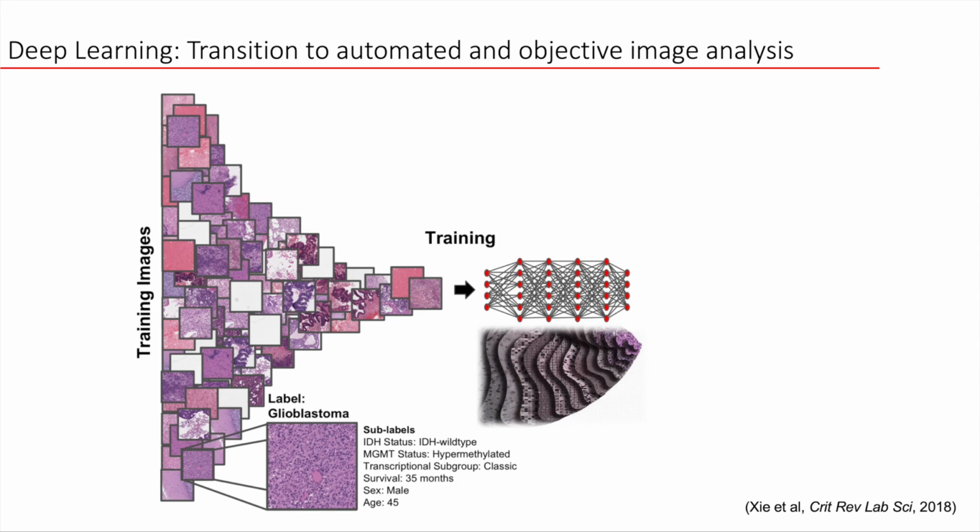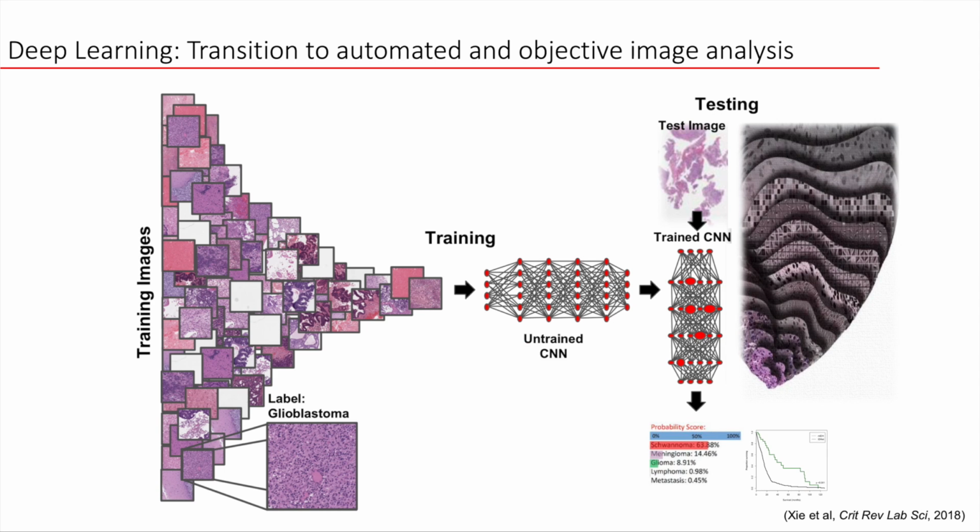So once you've trained your neural network and developed these features in what's called a data-driven manner, you can then present to it new images, which it will again feed through these multiple layers and again look for, at the basic level, lines and dots and circles, and it will start aggregating those again to create complex objects that are of diagnostic value.